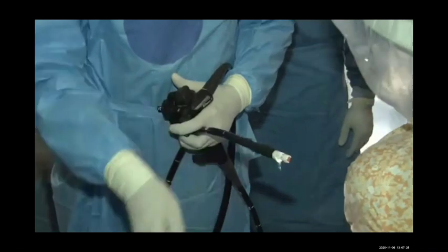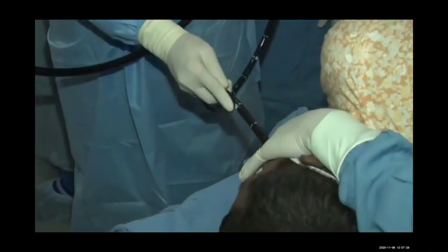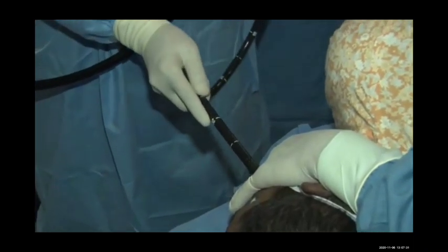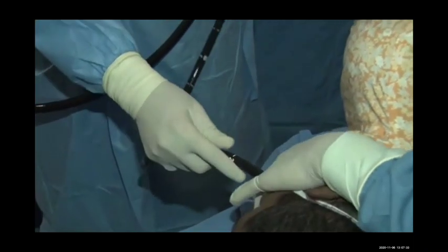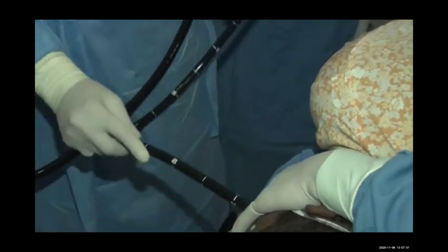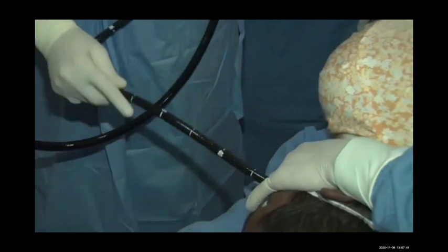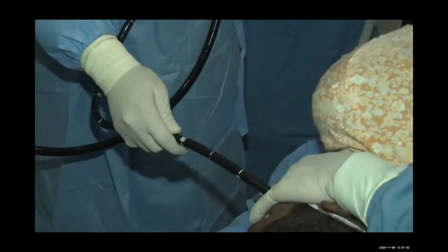Ideally, if the patient is actively bleeding, you should intubate the patient and then do the procedure. But here it is an elective procedure. He is not bleeding. He is referred for further management. He is under propofol sedation. And for all patients in this era, you have seen my mask is away because he is COVID negative. Otherwise, while doing the procedure, we always cover with an N95 mask. But this patient is COVID negative.